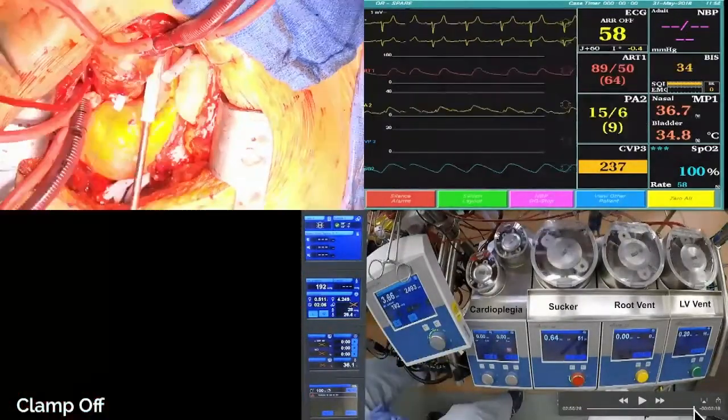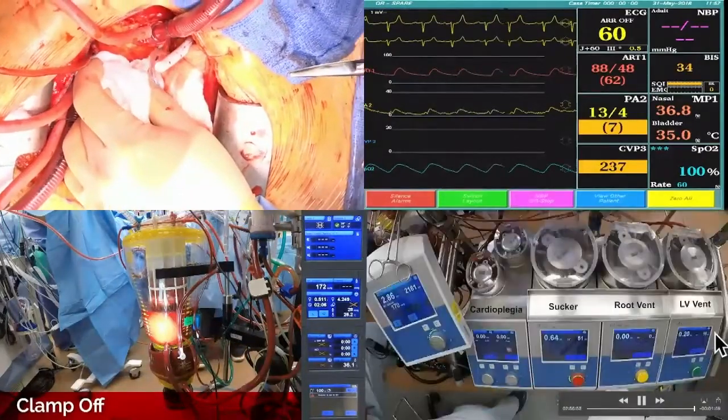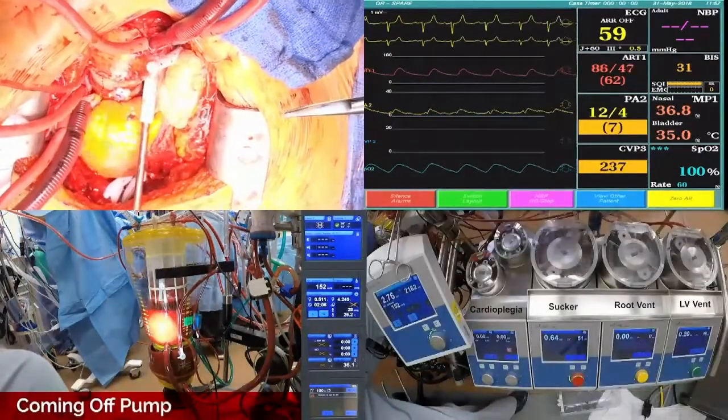Exactly. Same thing like when you put a spinal in, you go in, like in the pregnant lady epidural, so you don't get those leaks.